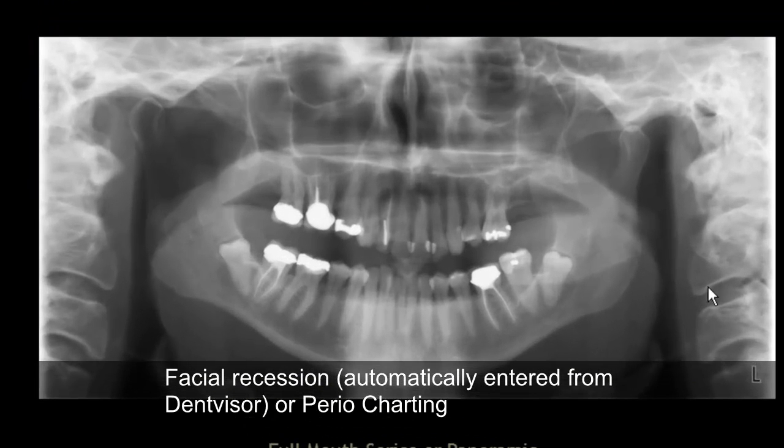Looking at the panoramic x-ray, you can see that on number 7 the post was misplaced by a previous dentist. So by redoing the restoration and removing the post, there is a possibility of root fracture. The patient was aware of it, and we left it as is and changed the restoration. She also has multiple cavities. She has a leaking restoration on number 2 and number 3. Lately we had to extract number 31 because of a vertical fracture. Again, she has multiple cavities, and we have to control them.